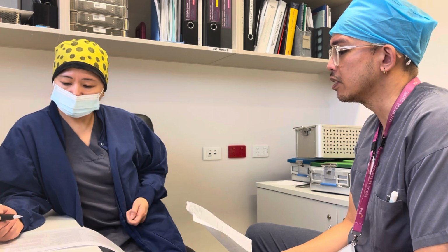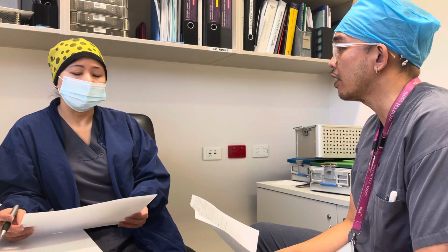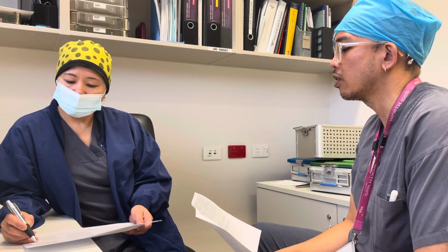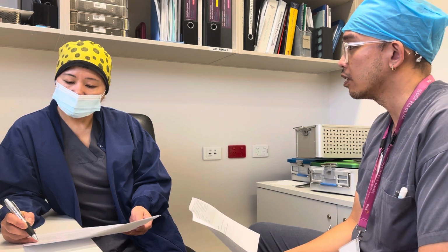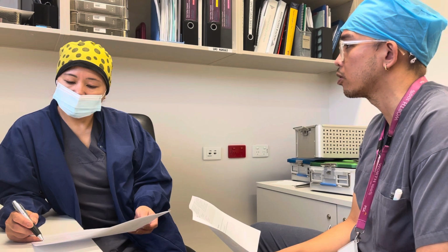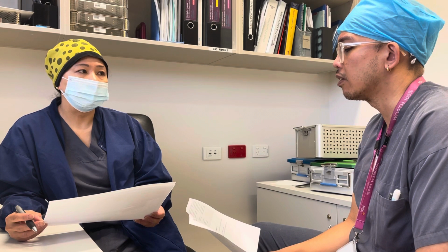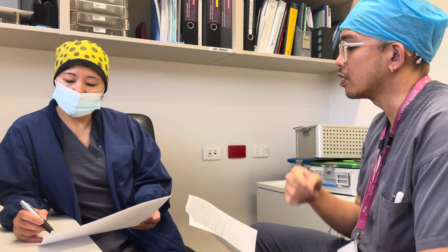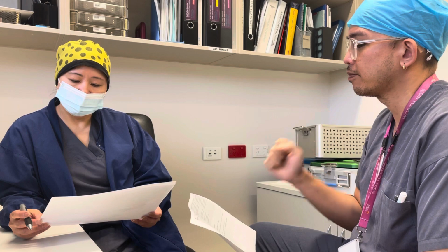8134 applies to services or service providers that are subject to the Health and Disability Services Safety Act 2001 and Human Assisted Reproductive Technology Act 2004. Services that are not under the above two acts should still consider adopting the standard because of its promotion of best practices. And private and public health and disability services providers, from small single operator services to large publicly funded ones like hospitals, are covered by the 8134 standard.